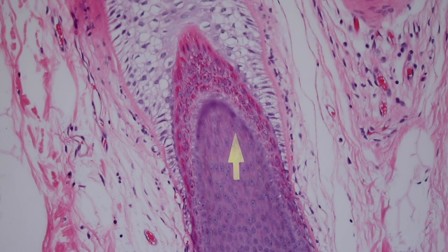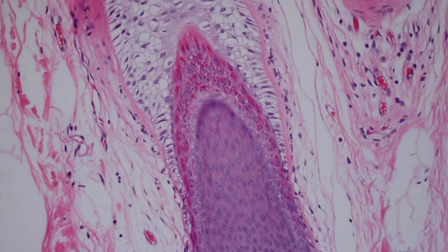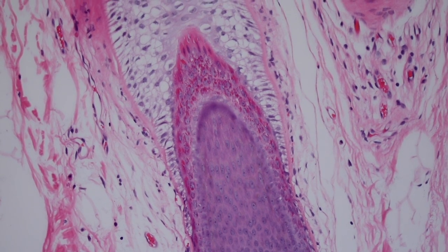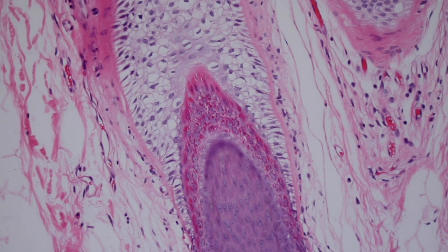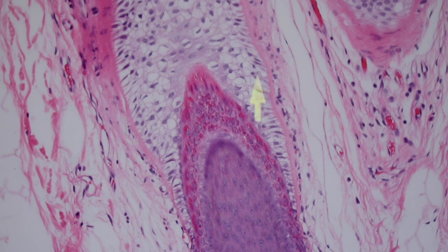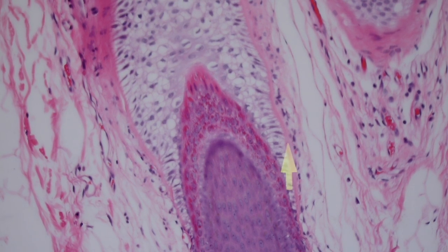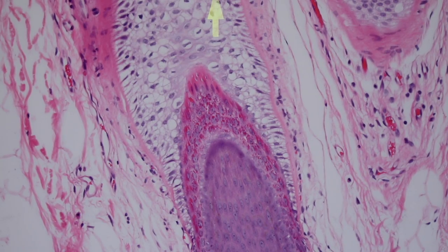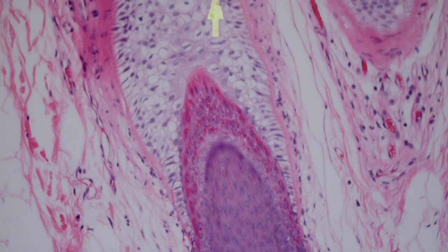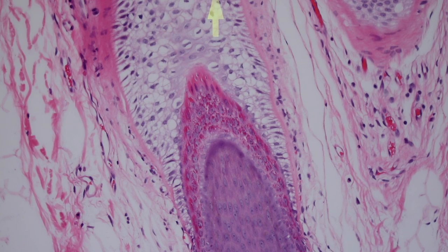The inner root sheath has a couple of layers — a cuticle, a Henle layer, and a Huxley layer — though those aren't really important for most medical students or pathologists to know. On the outside is this outer layer that looks very different: it has very clear, columnar, tall cells that some people think look like piano keys. That's called the outer root sheath, and it's clear because the cells are filled with glycogen, which washes away during tissue processing and leaves these clear spaces.